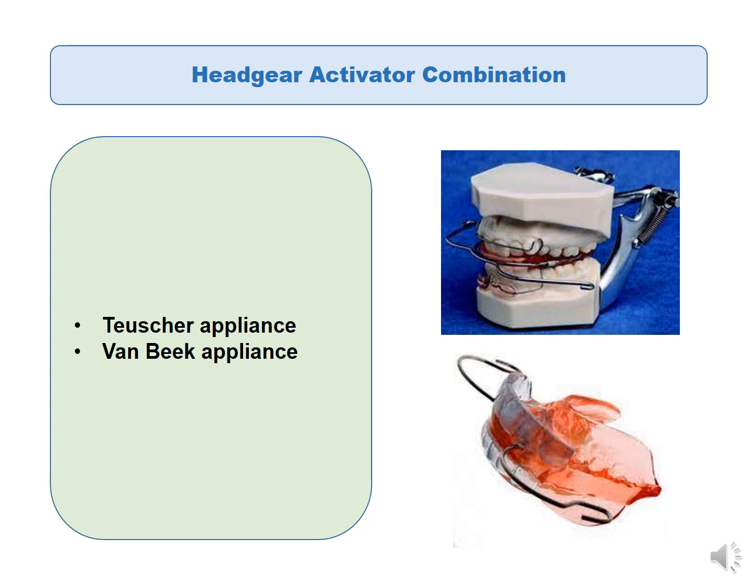Now, the activator can also be modified to accommodate headgear for orthopedic action as well, and two examples of these are the Teuscher appliance and the Van Beek appliance.